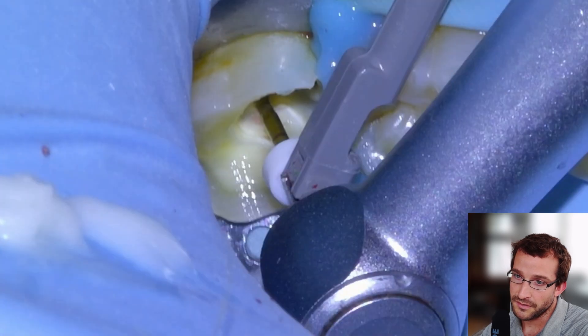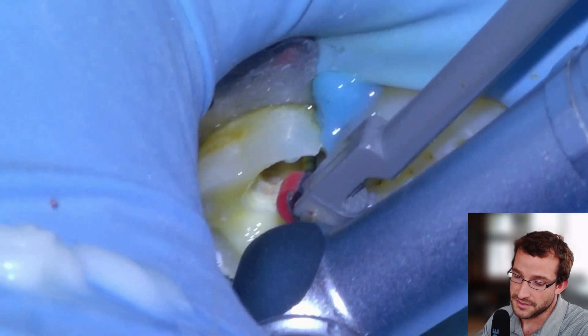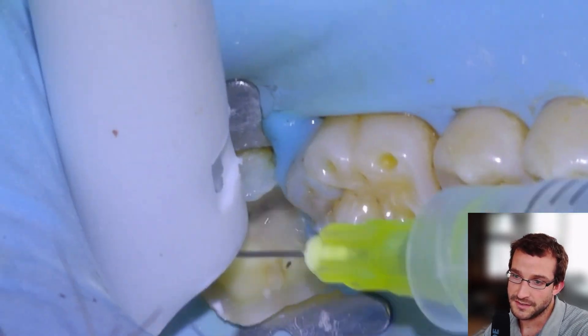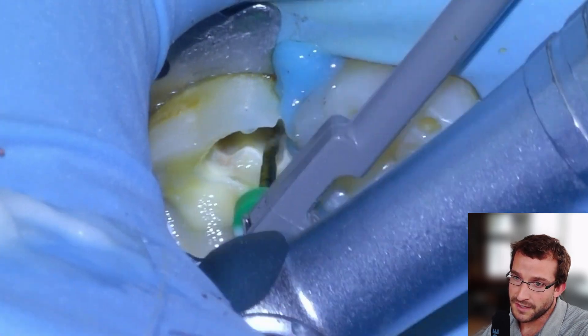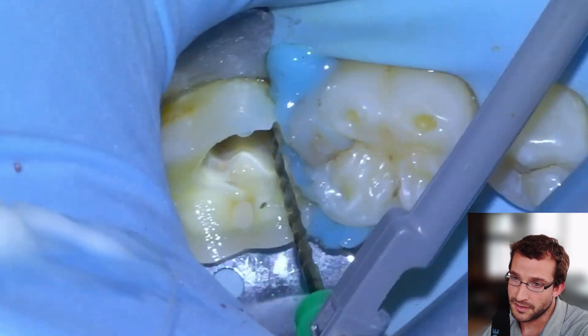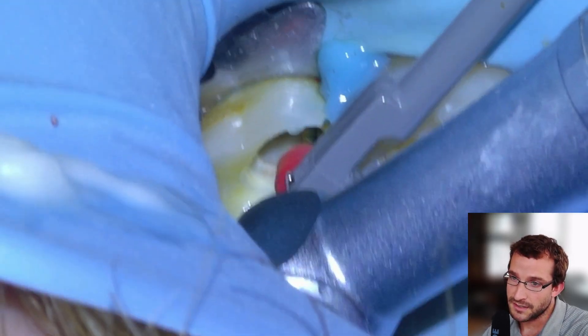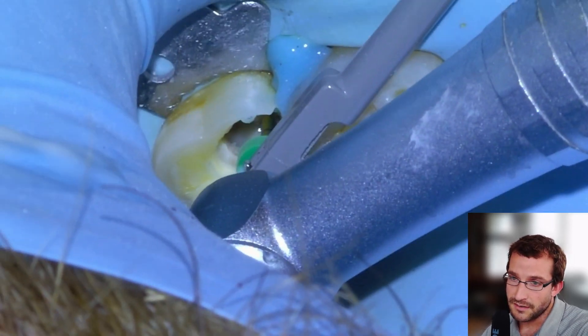15/04 down the mesials. We can probably skip the distal since they're usually wide open and you can usually go right to a 25/06 for the larger canals. Then the 35/04 is going to be our final file before we're ready to do a final irrigation, activation, dry it, and obturate.